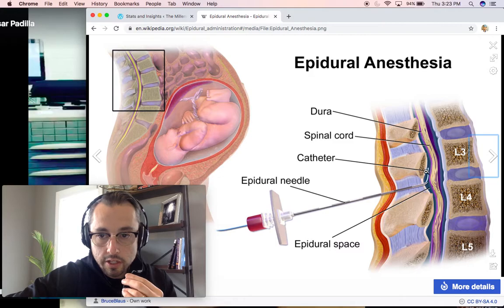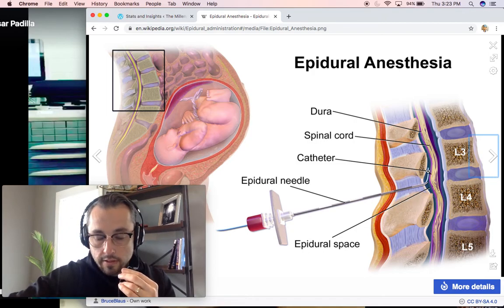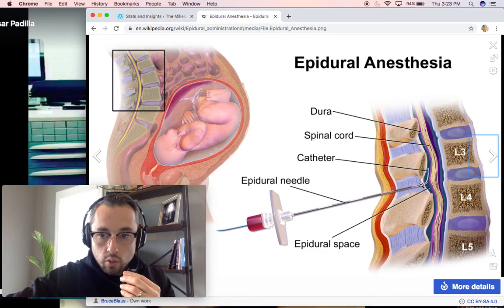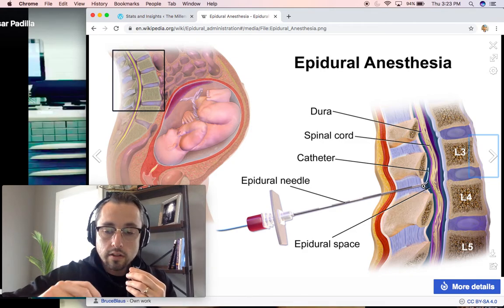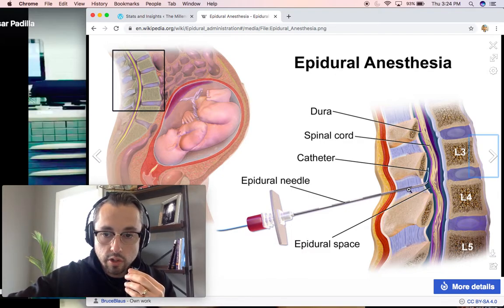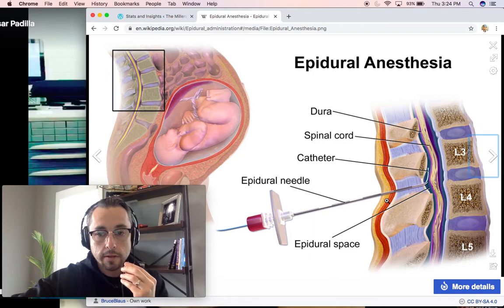But you can just imagine, if this is pretty close to human size when you're opening it up on a regular screen, you don't have a lot of room. So a lot of this is just things that you feel. Once you approach the epidural space, you're going to have a loss, or a give in your pressure. You have a lot of pressure as you're going through these ligaments here, and then boom, you lose that pressure, and that's when you approach the epidural space.